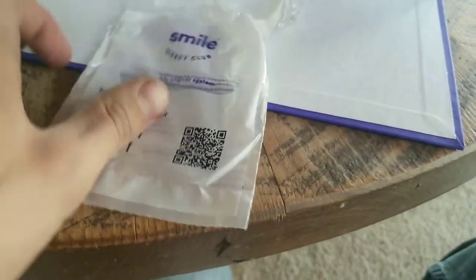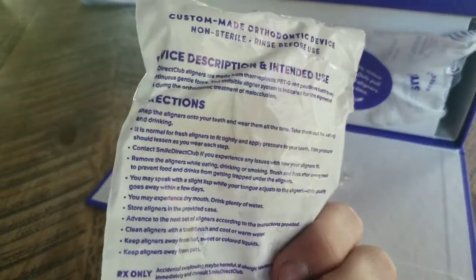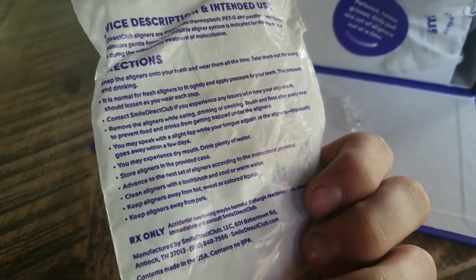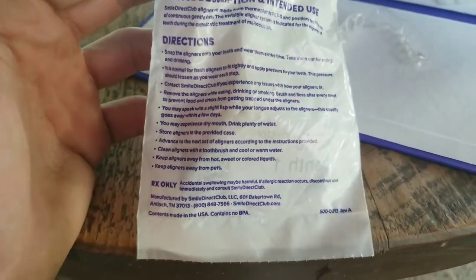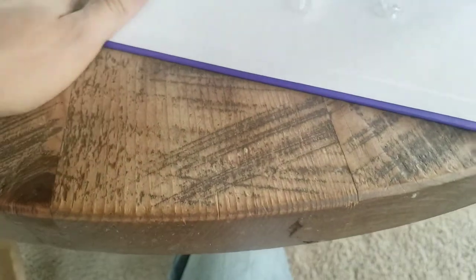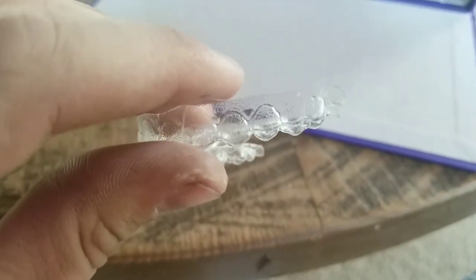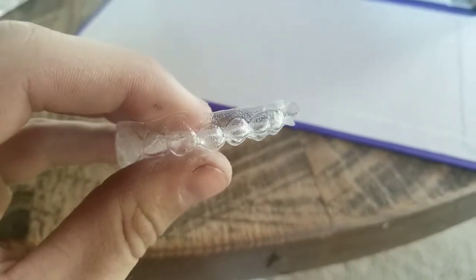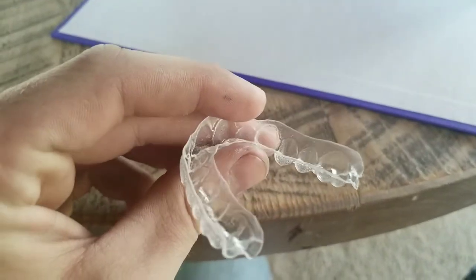So this is what your first set looks like — month one, week one, and how to do it. You're not supposed to drink anything other than water when they're in, no eating, all that kind of stuff. It tells you if they don't fit, call them; clean them; keep away from pets. The only downfall I have is — they're not very clear. They're actually somewhat noticeable. It doesn't bug me, but I feel like some people might have an issue with that.